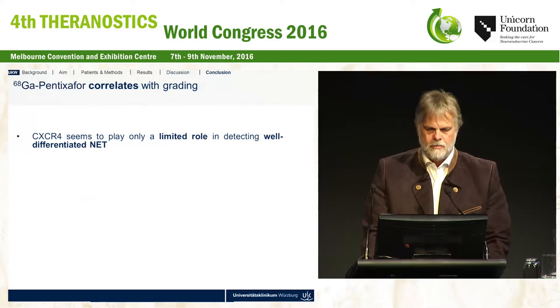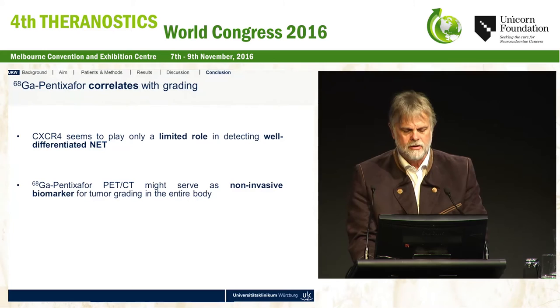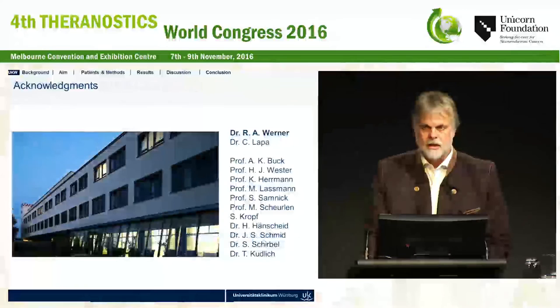But on the other hand, CXCR4 seems to play a limited role in detecting well-differentiated neuroendocrine tumors, which is to be expected. It might serve as a non-invasive biomarker for tumor grading in the entire body. As I've shown you before, we saw some lesions that weren't discovered either with FDG PET or with DOTATOC. And also, as we have some experience already with endoradiotherapy with CXCR4, it could possibly open a new treatment option in advanced dedifferentiated tumors which are SSTR negative. And with this, I would like to thank you for your attention.